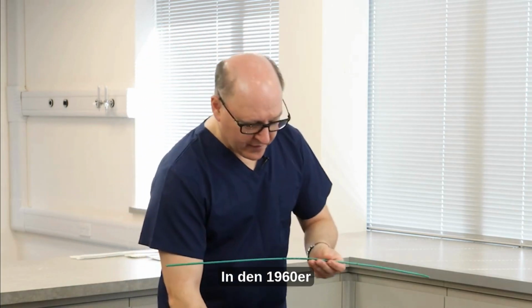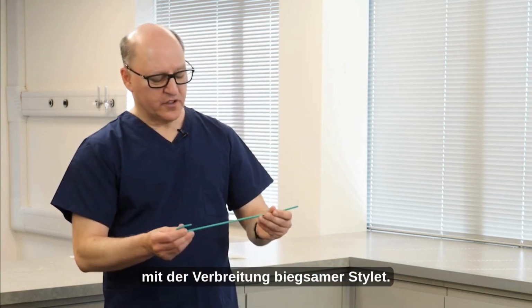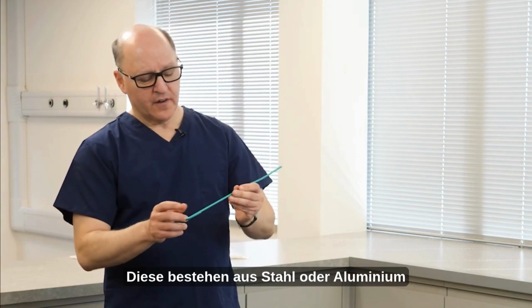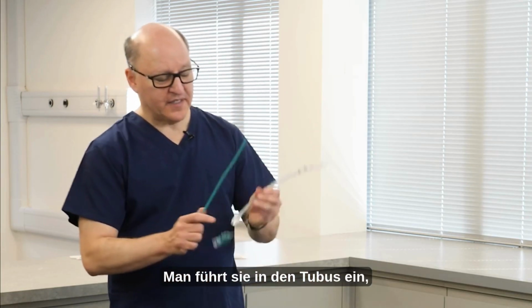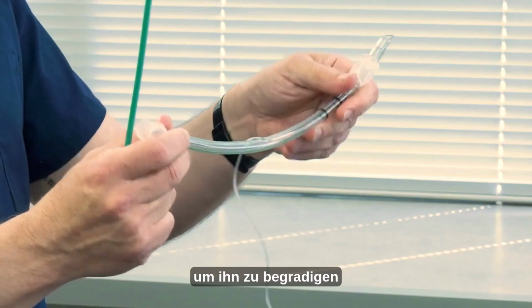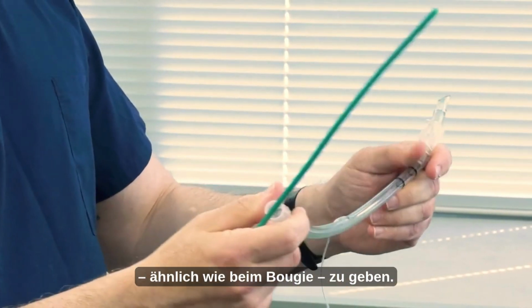And then in the 1960s, 1970s, a number of manufacturers, especially in the US, promoted the use of a malleable stylet. And these are either steel or aluminum with a thin plastic cover over them that could be placed inside the tracheal tube to straighten it out and basically give it a long and narrow shape with a distal deflection similar to the Bougie.